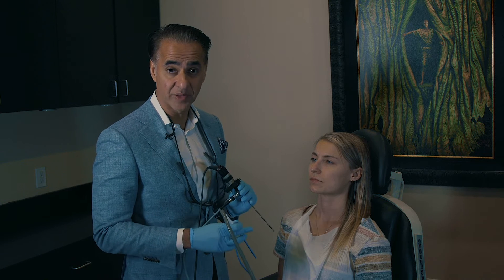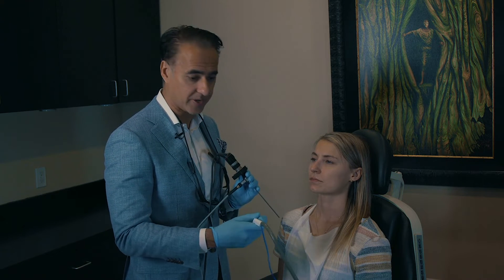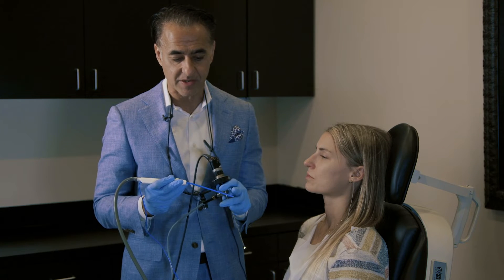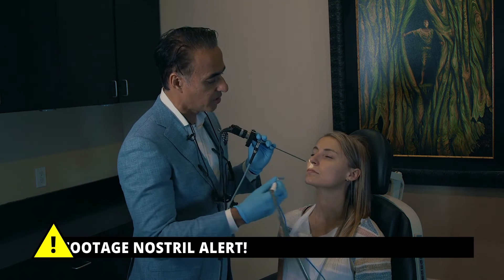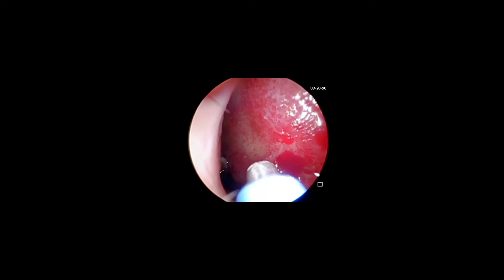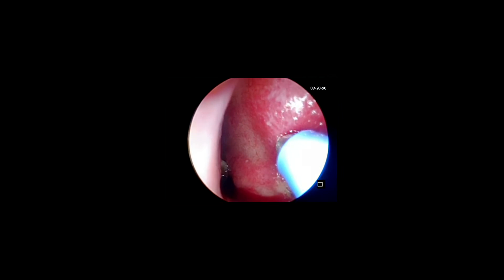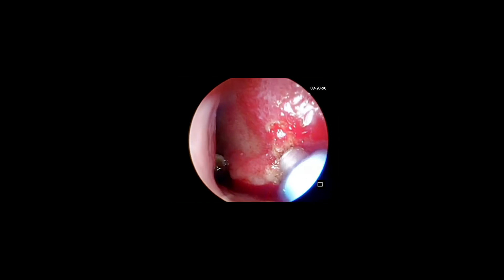Now that we've identified where the bleeding source is, we're going to go ahead and seal those vessels using electrocautery. This is called electrocautery — it has a little suction, and at the very tip it produces a little bit of electricity that seals the vessels. We'll place this easily in the nose, and as you can see here in the very front, this is where she's actively bleeding. We're going to cauterize those sites by applying just a little bit of pressure and electricity to seal those active points.